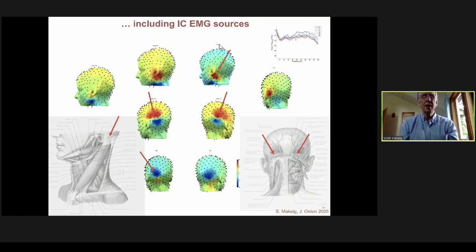Their signature is a polarity reversal at the end of the muscle and the insertion into the tendon. And you can see from the location and from the angle of the polarity reversal, you can get some idea here in Gray's Anatomy what muscles they may be. I think someone is doing a PhD dissertation using needles to verify that this recording was of this muscle and so on. Well, I don't know which correspond here.